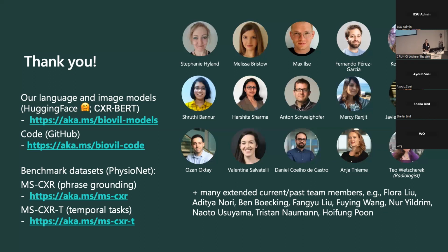And then the second question is, have you also used CT images, or not the images per se, but the reports? Because often in the ICU, we have chest x-rays and then CTs quite soon afterwards. And there's often a degree of interpretation of the chest radiograph by the radiologist, but the CT is kind of definitive. That's the gold standard ground truth. So could you augment your text encoding with an additional bit of data, essentially? Yeah, if you have a CT data set we could use, that would be great.